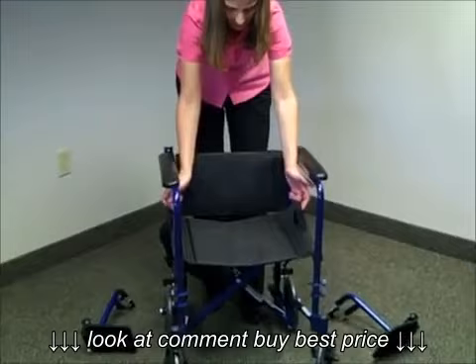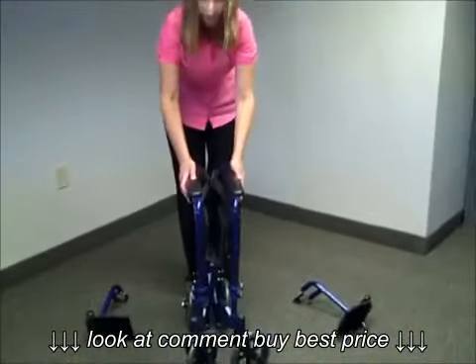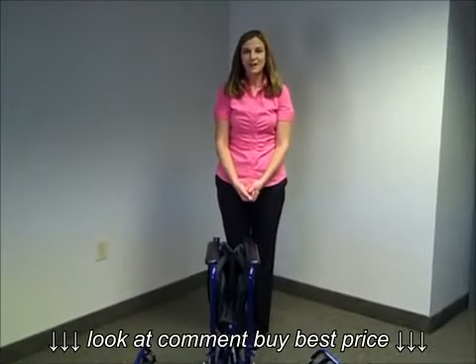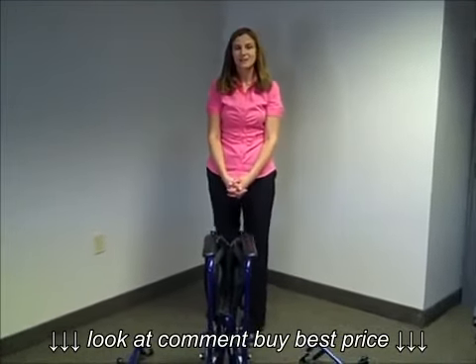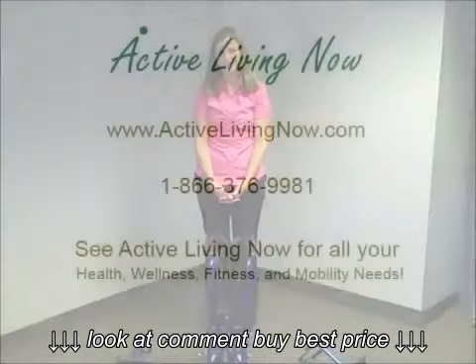Notice there's two handles on the seat — pull up and the chair will fold. Now your chair is ready to be transported. I'm Shannon with Active Living Now and remember to visit ActiveLivingNow.com for all your health, wellness, fitness, bathroom safety, and mobility needs.